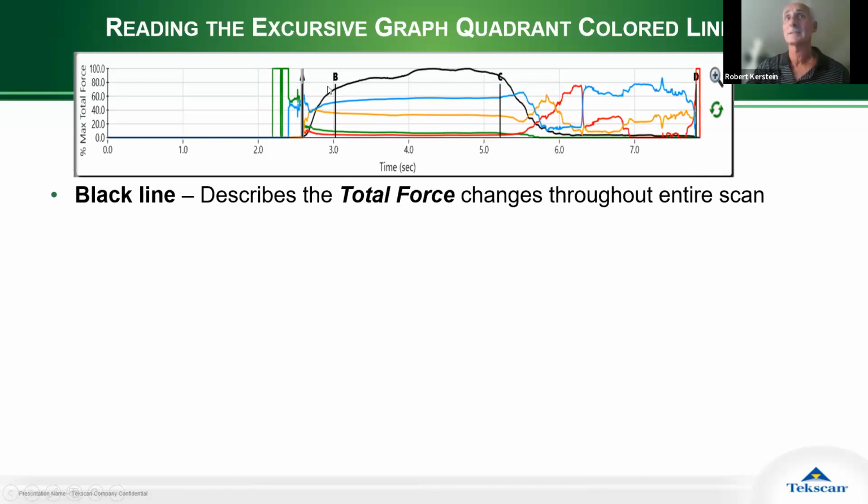Here, the black line is saying the patient bites down weakly, struggles to get to their MIP, can't do it, is made to squeeze harder, they waver some, and then they make their excursion here. And in their excursion, they have friction. That's the steps in the black line.